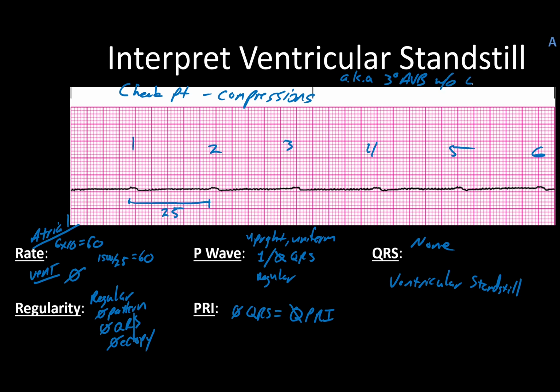Without escape rhythm. Ultimately, with your interventions, you're going to need pads to pace them with, and might wind up being reasonably successful doing so. But this is a stat scenario. There is no blood movement whatsoever. And call that the sudden cardiac arrest.